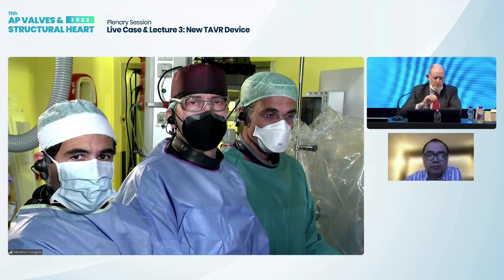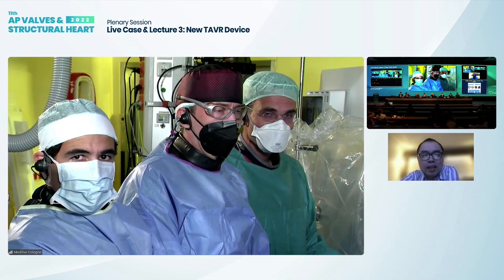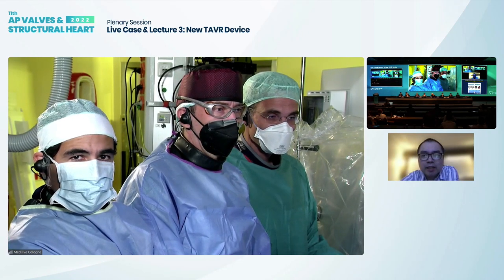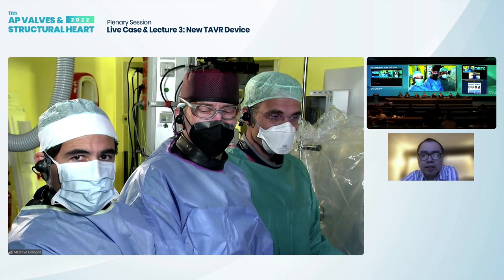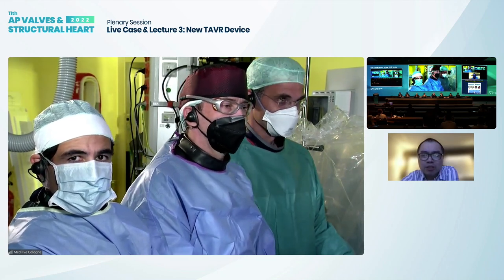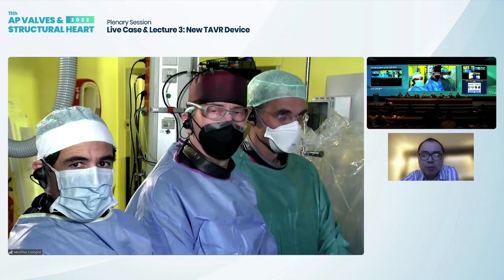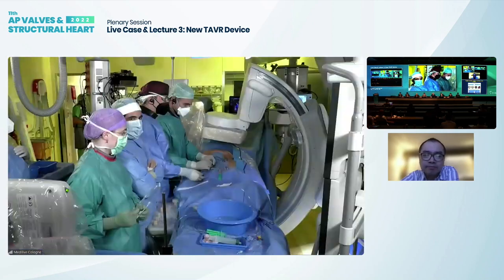Yeah, Jared, are you familiar with the JenaValve at all? I echo Jim. We also in Australia don't have access to the JenaValve, and certainly we've done it for aortic regurgitation, but typically just using a commercially available valve tends to be more self-expanding valve in Australia gets used by a lot of oversizing.